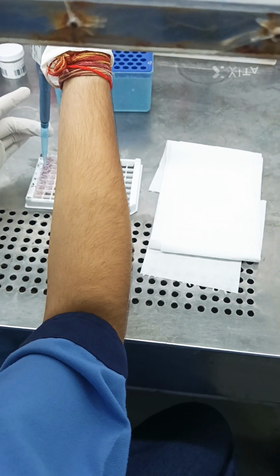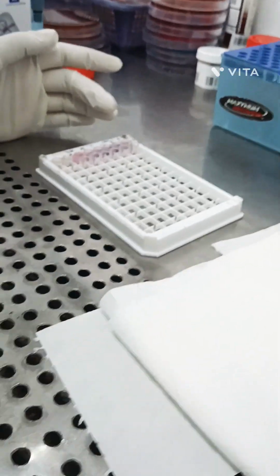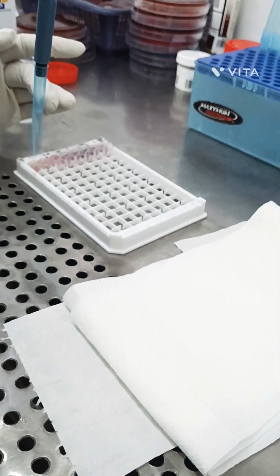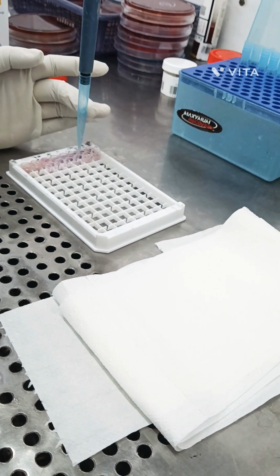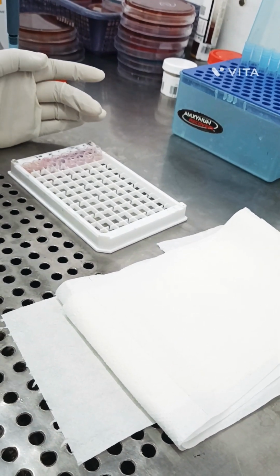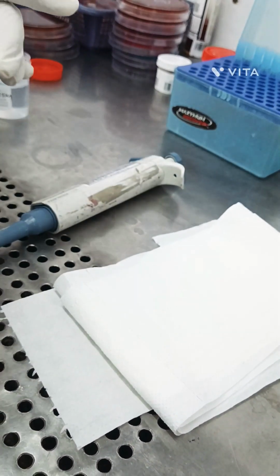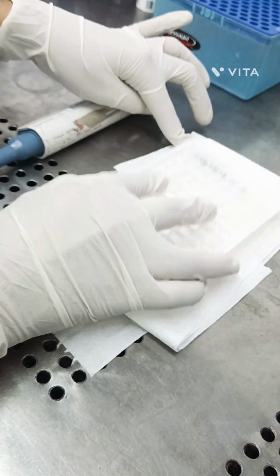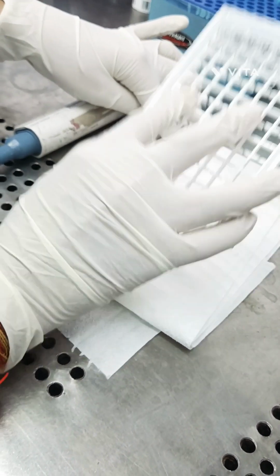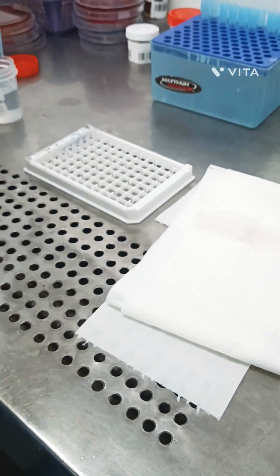Dispense washing buffer, which is 20x concentration. How to dilute it? 20x means 1:20, so take 1 part concentrated buffer and 19 parts distilled water.